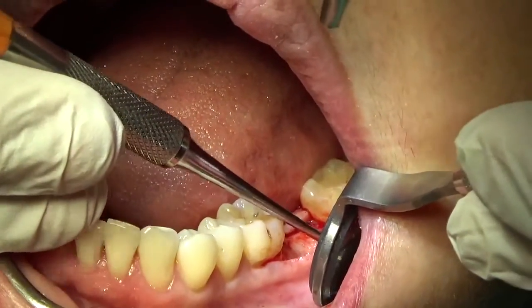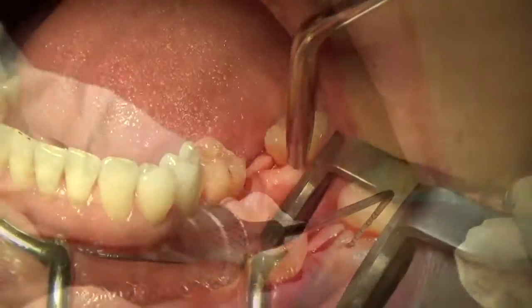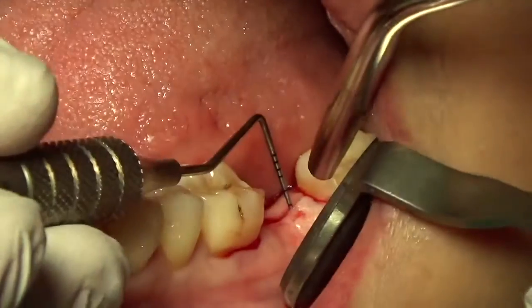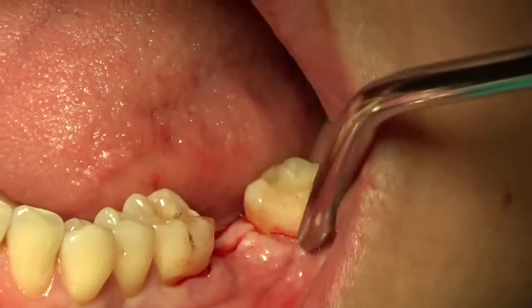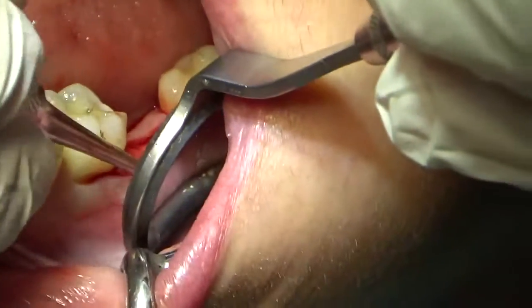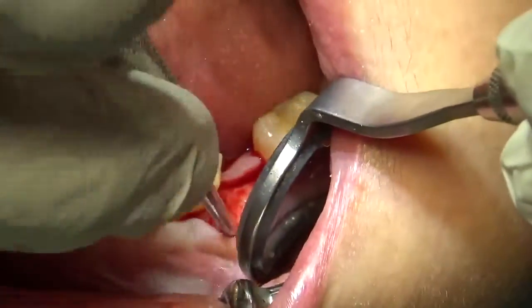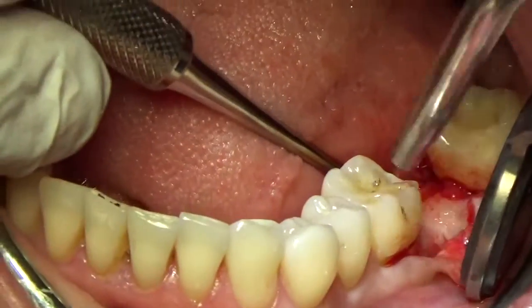This soft tissue is pretty thick actually. It's 2-3 millimeters thick. We could actually measure it here. Or we can actually measure it like this. So we've got about 3 millimeters of thickness. So this is good thick tissue here. So if we're going for zero bone loss concepts, then we're going to want 4 millimeters from the implant to that soft tissue. So maybe we wanted a millimeter subcrestal. So now we can really visualize the defect in the area. We have a nice full thickness flap ready for our implant.